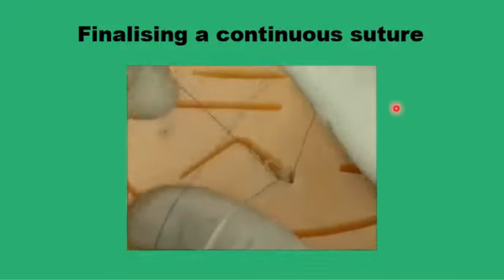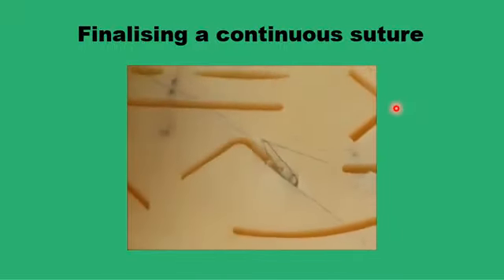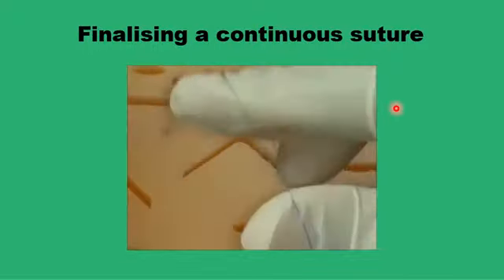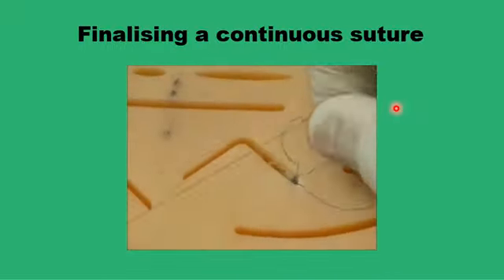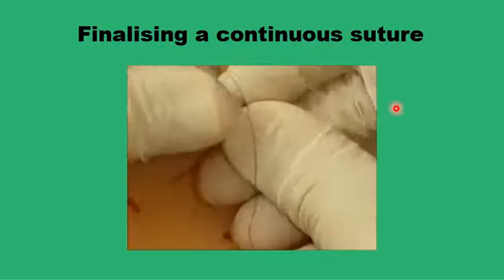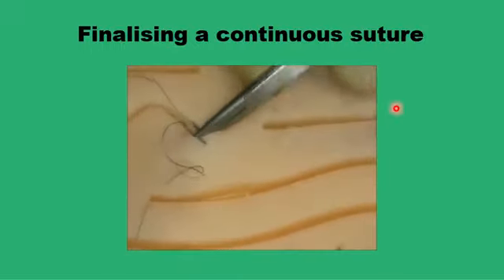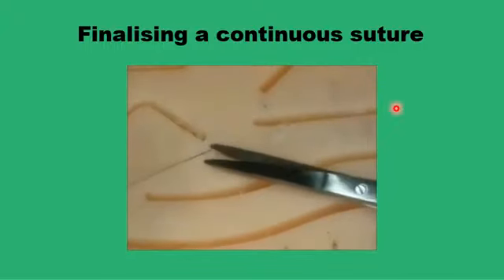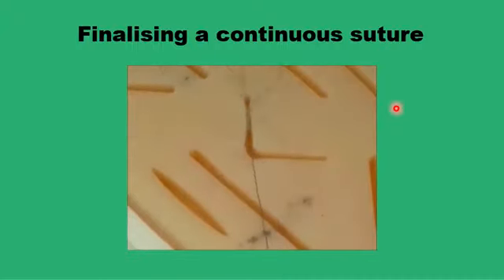After having the last stitch, you take a loop of the suture line, pull another loop through it, do the same again. From the newly formed loop, you pull another loop and go on, do this maybe 6 or 7 times until you have a secure knot. Then pass the needle back through the last loop and then bury the knot under the skin edges by taking a suture at the apex and cutting flush with the skin, and this is going to bury the knot.